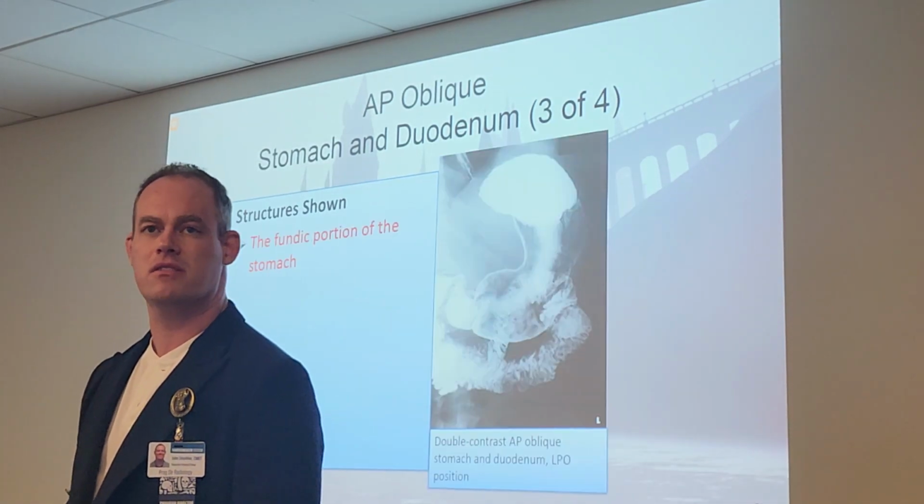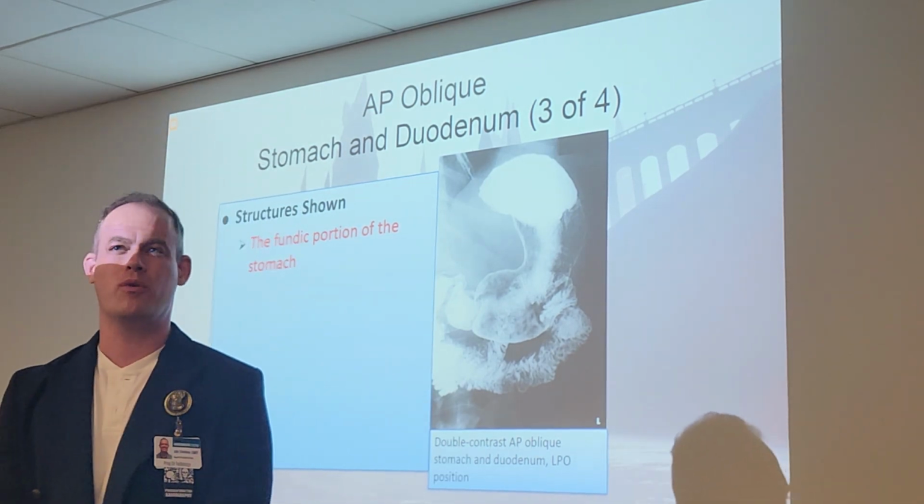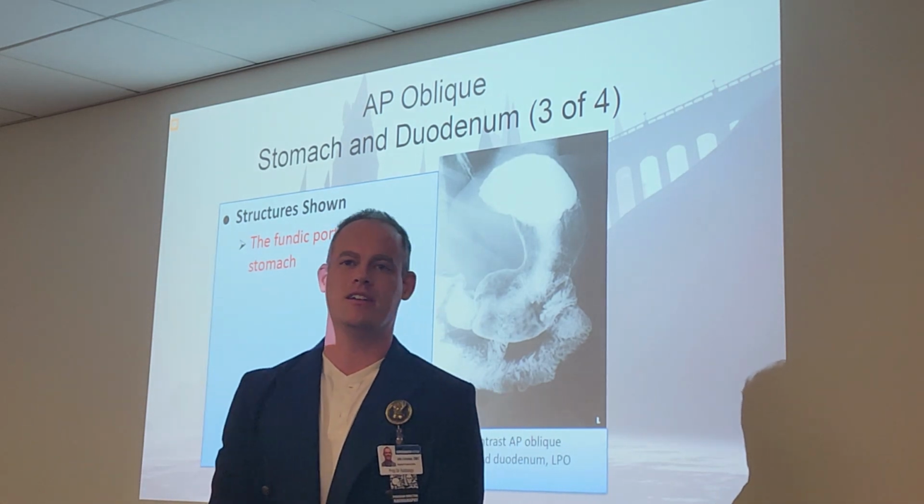Okay, perpendicular central ray. We're still suspending on expiration. That has not changed. Well, look, that's so simple. I got nice and simple for you. What are we interested in on this position? The fundus. Fundic portion of the stomach, the fundus.